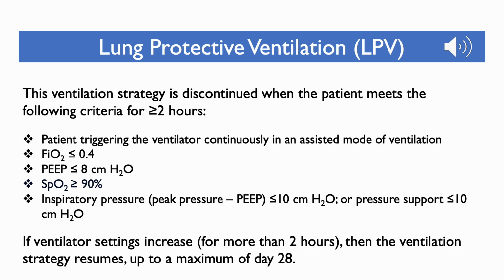Once the patient recovers from respiratory failure, the intervention can be discontinued. The criteria for discontinuing the intervention are as follows. The patient should be triggering the ventilator continuously. The FiO2 must be less than or equal to 40%.